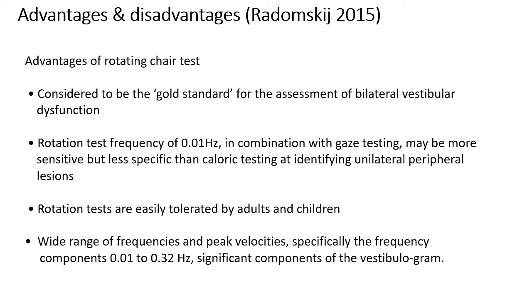It's also easily tolerated by adults and children, and it will test a wide range of frequency and peak velocity, specifically the frequency components 0.01 to 0.32 Hz, which are significant components of the vestibulogram.